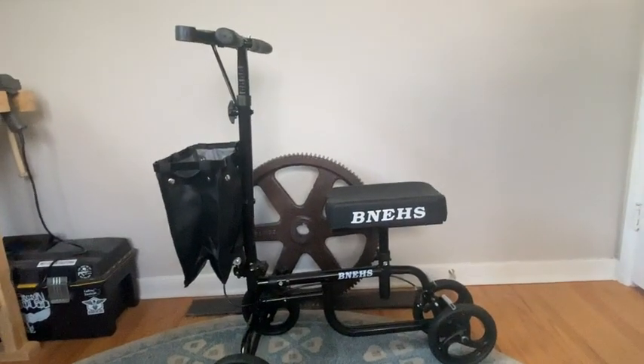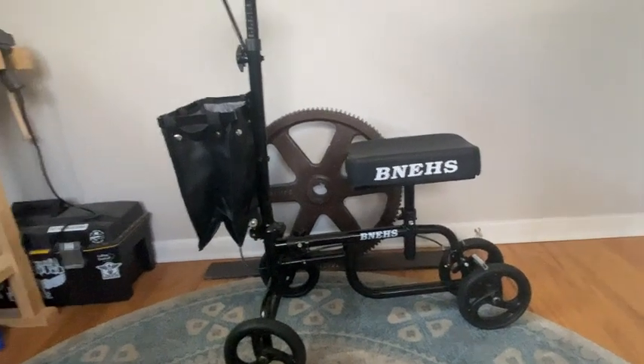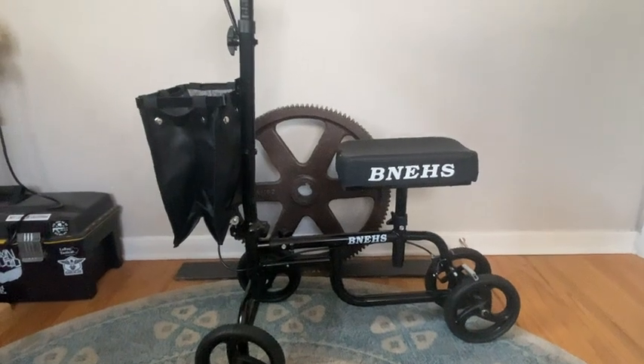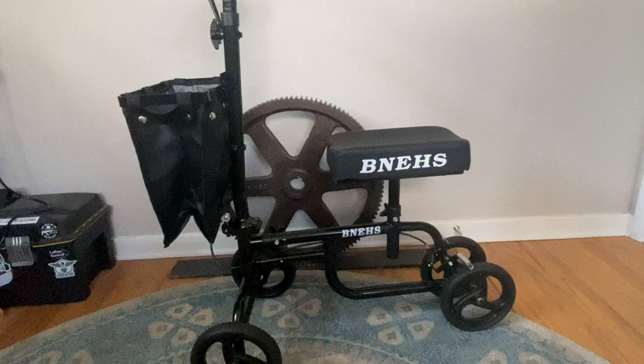So my dad has a foot surgery coming up in two weeks. He was saying he didn't want to get around on crutches. He's a bigger guy, so I figured crutches would probably be less safe — he might injure himself another way. So I got him a knee scooter.